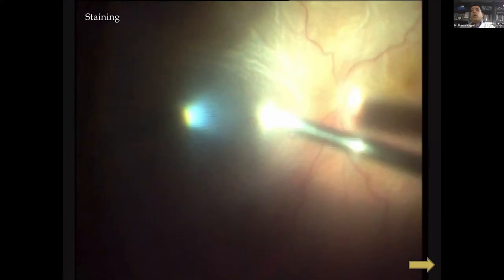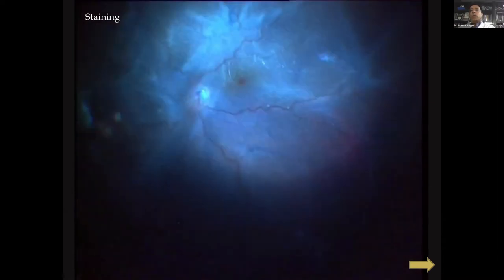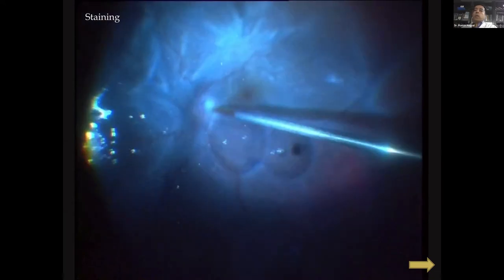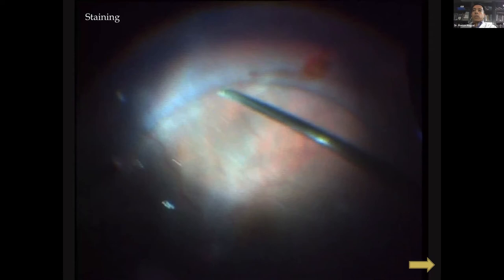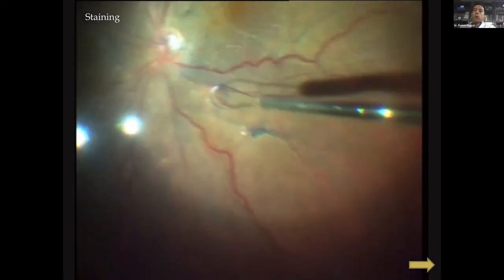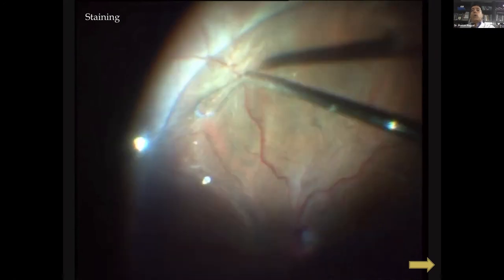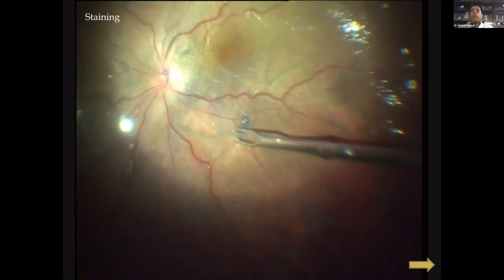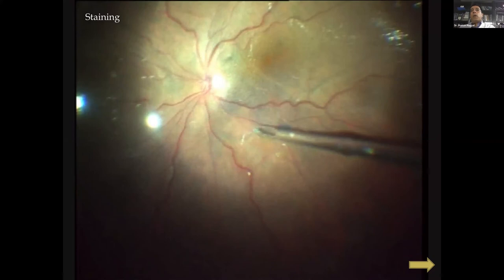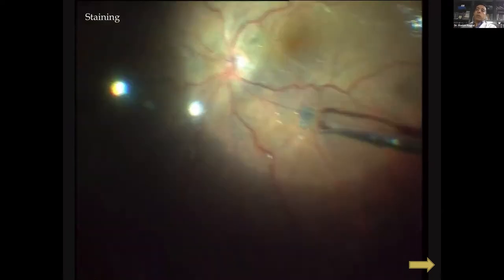This is a case of PVR with no classic puckers but with stria and ill-formed star folds. When you peel, you may not find a membrane easily, so it's a good idea to stain — after removing the vitreous, put a stain inside. Using a finesse loop and gradually moving it over these folds, you can iron out the folds and may find a membrane edge or ILM that helps release the ill-formed membrane. This approach is useful in situations with ill-formed star folds and no definite membrane.